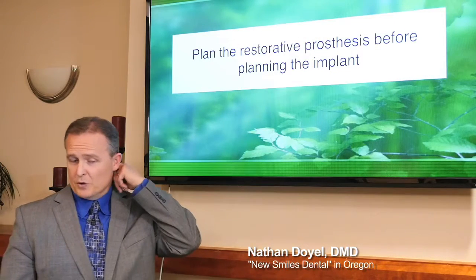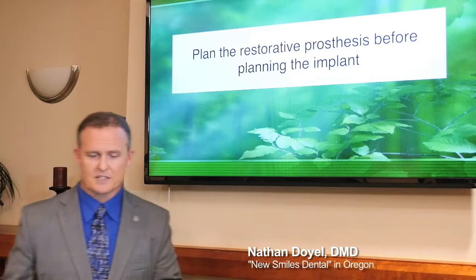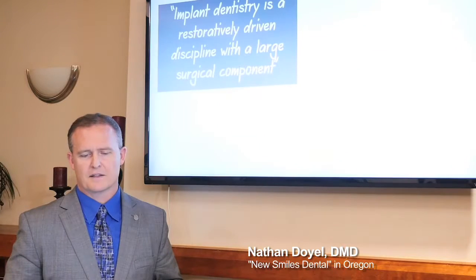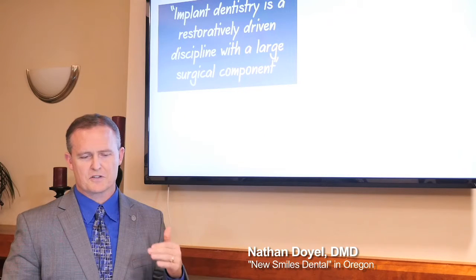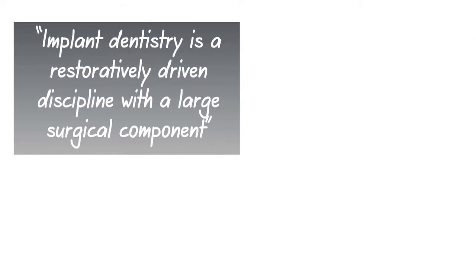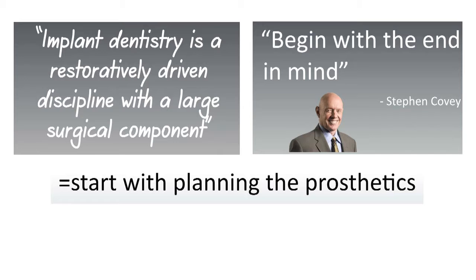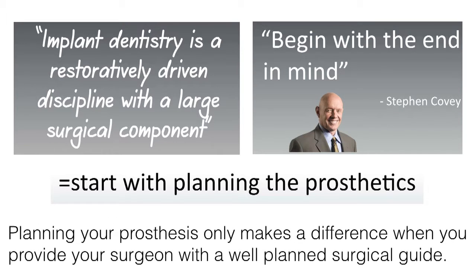One thing I want to make sure you do is plan the restorative prosthesis before planning the implant. So planning, beginning with the end in mind, again, this is Stephen Covey's. Implant dentistry is a restorative-driven discipline with a large surgical component, but we want to begin with the end in mind. So we have to be driven by the restorative portion of it. Again, start planning with the prosthesis. If you're planning an implant that won't let you place a restorative portion at the end, then there's no really good reason for that implant to be there in the first place.